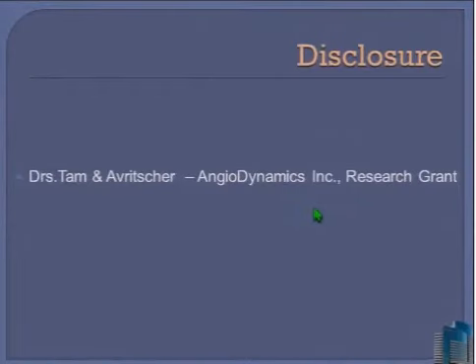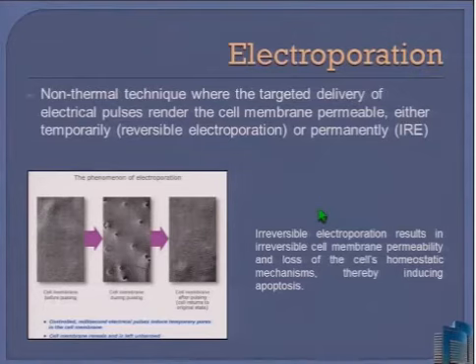This is our disclosure. This is an off-label use for the IRE. Electroporation is a non-thermal technique where the targeted delivery of electrical pulses renders the cell membrane permeable. This could be either temporary or permanent.